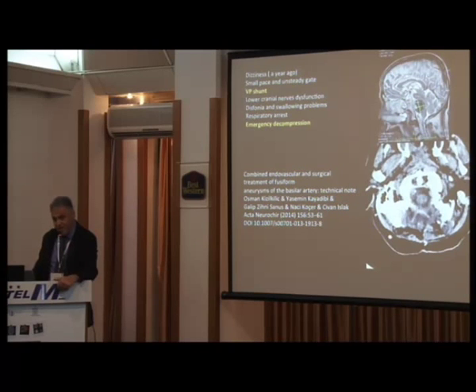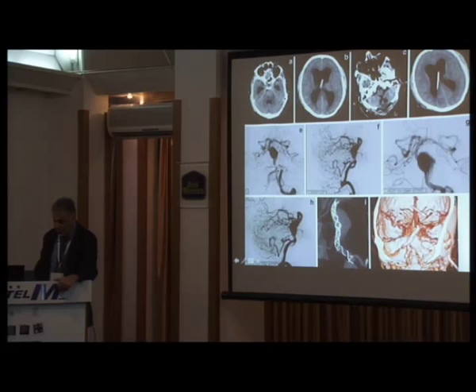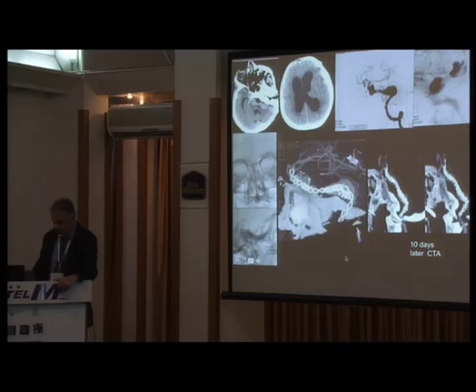So it is happening in that complex group, especially my most difficult group, the fusiform basilar aneurysm. Technically it is very easy, but the clinical results are not so good. Look at that, the fusiform aneurysm. We have a technique in our hospital to prevent the compression effect after thrombosis. We are opening a window in the occipital bone. We are putting in a shunt before giving aspirin and Plavix. And then after the shunt and the window, we are putting flow diverters to reconstruct the basilar artery. From time to time we have very good results like this.